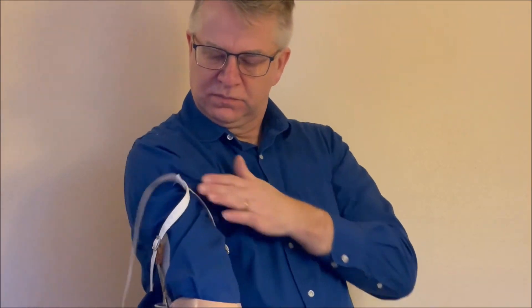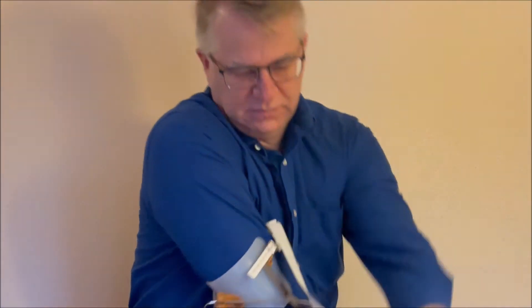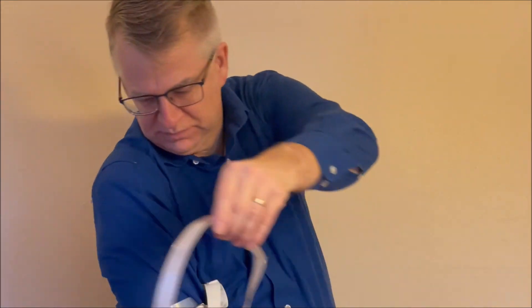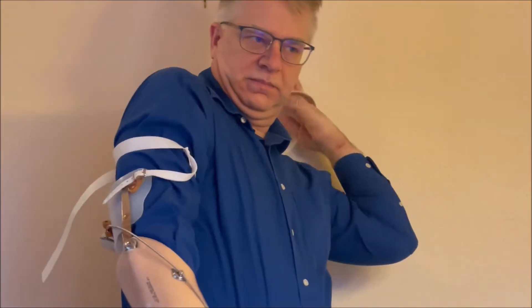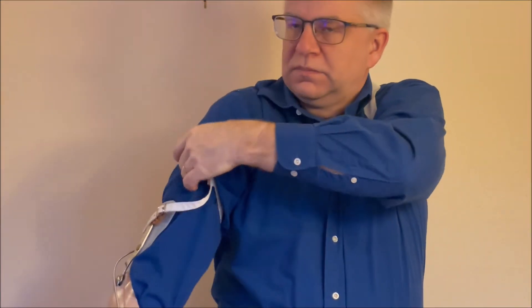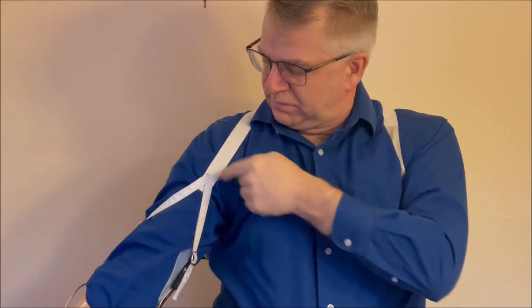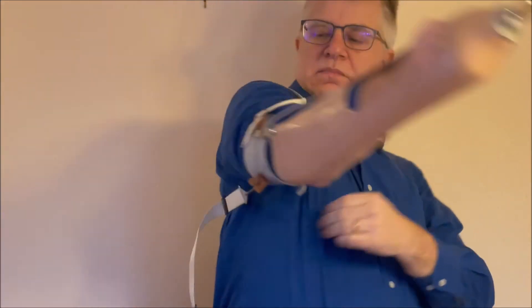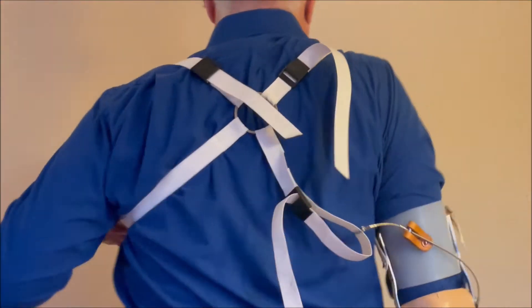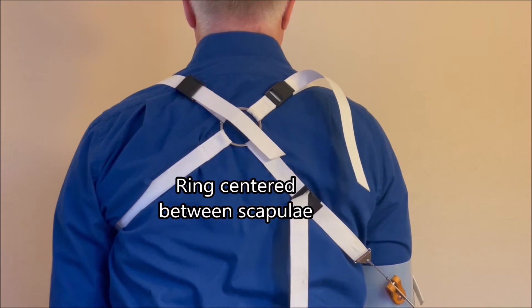Once you have that, you're going to put it on using the coat donning method. The Y yoke should be in front of your arm, the wider strap should be in back of your arm, and you're going to bring it around your back and then put your other arm through the axilla loop, just like you were donning a coat. Make sure the Y yoke goes in front of your right shoulder, and make sure the wider strap connected to the terminal device is behind your back. The ring should be centered between your scapula.